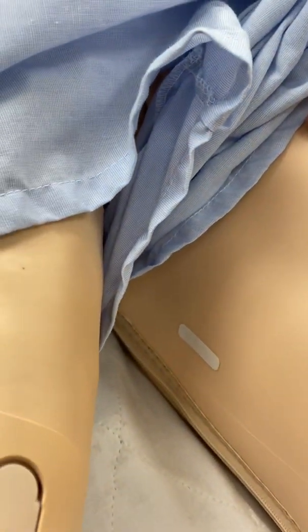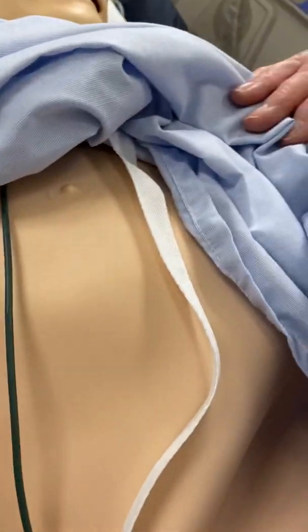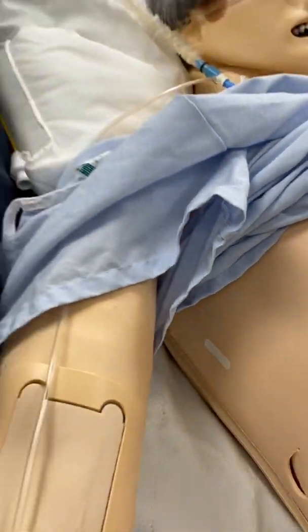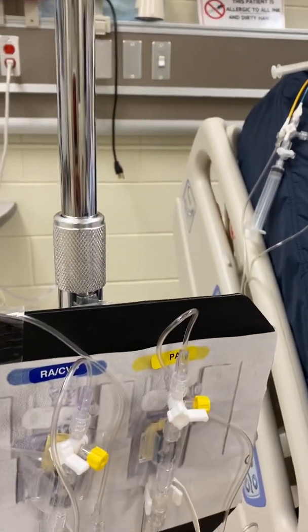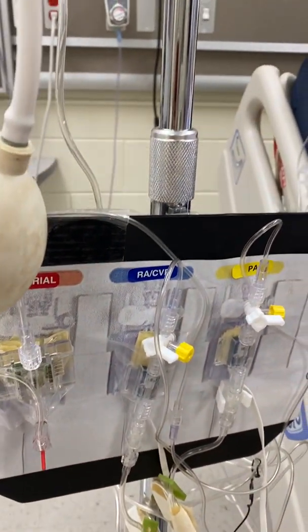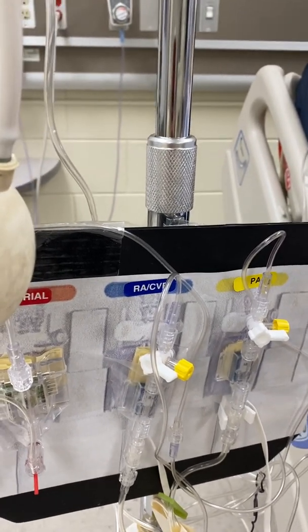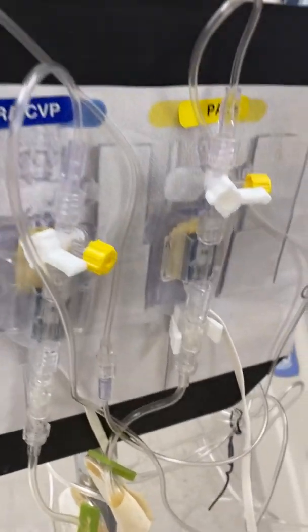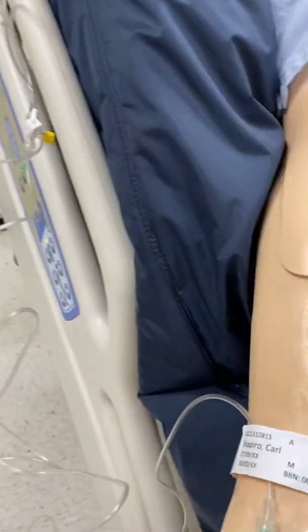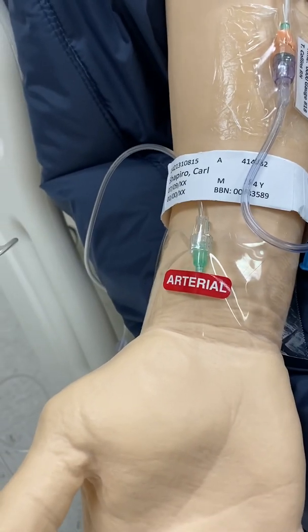So if we had a level, then we would use that level and go from that point right there, the phlebostatic axis, and we would make sure that our transducers were at the same level. If not, you're going to get incorrect readings, and why go to all this trouble if you're going to have an incorrect reading, okay? Again, here's another example of that arterial line that she's got set up for you.